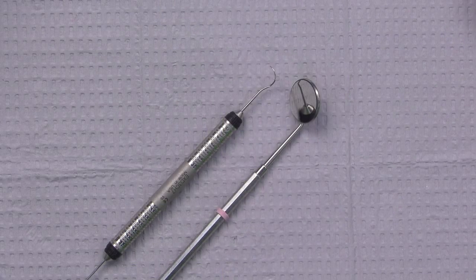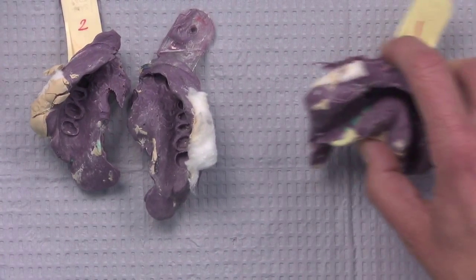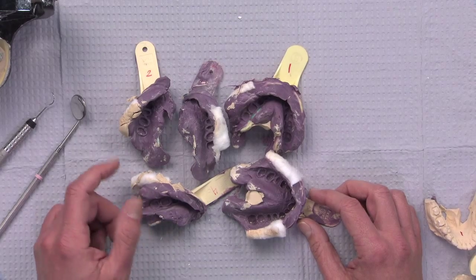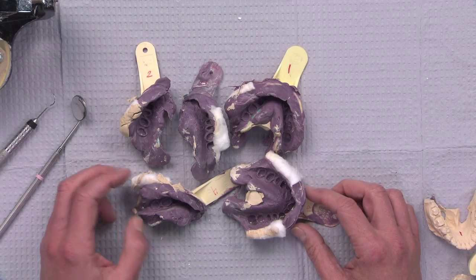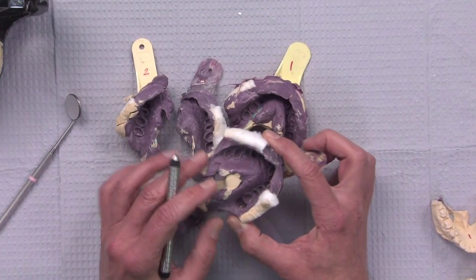I was walking through the fix department the other day and I saw this case, and it looked just a little odd in the box, so I had to take a closer look at it to see what was going on. I don't want to sound like I don't feel sorry for the doctor here, because I know that this had to be a frustrating case when you look at all the different impressions that this doctor took. So we've got two full arch impressions, and then three quadrant impressions, and it's actually a good size case. He's got 8 units here that he's prepared, as we'll see when we look a little closer at the models. But just to look at the impressions first, and maybe the reasons why there needed to be so many impressions.